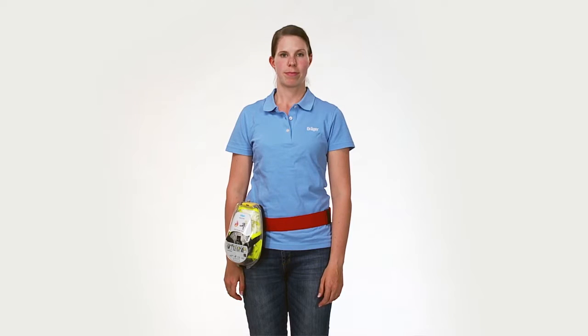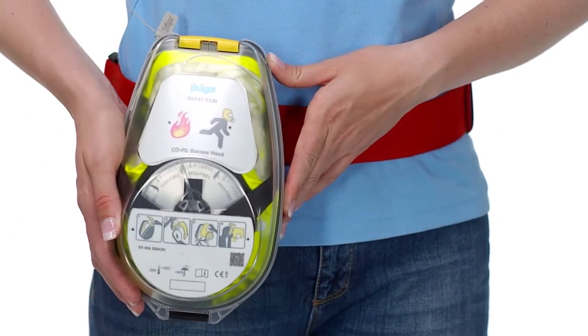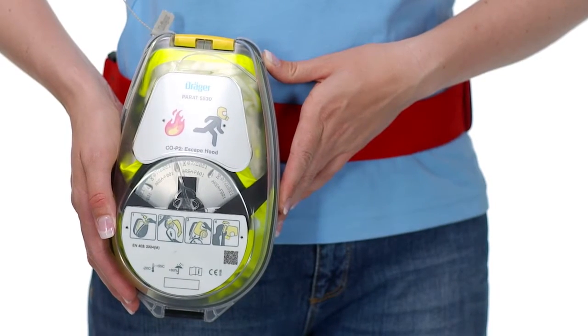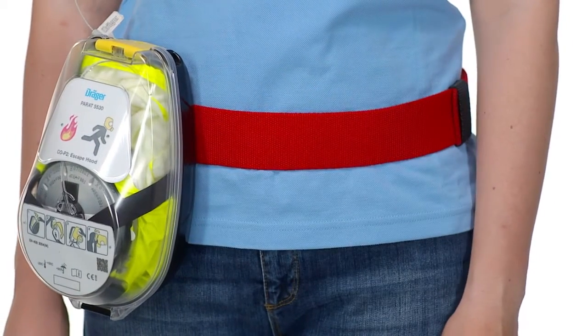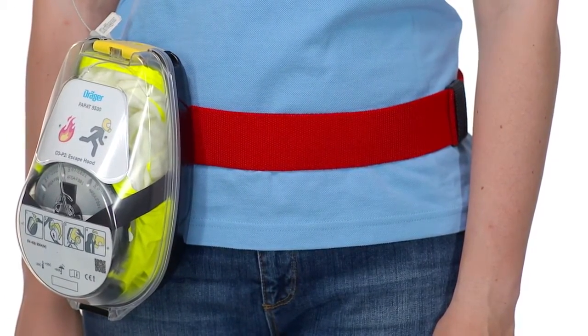The Parat hard case is a robust case which reliably withstands the strains of wind and weather. The hard case is sufficiently sealed and has an IP54 splash water protection level. In the case of an accident, the Draeger-Parat escape hood inside the hard case can be easily opened, removed and donned.